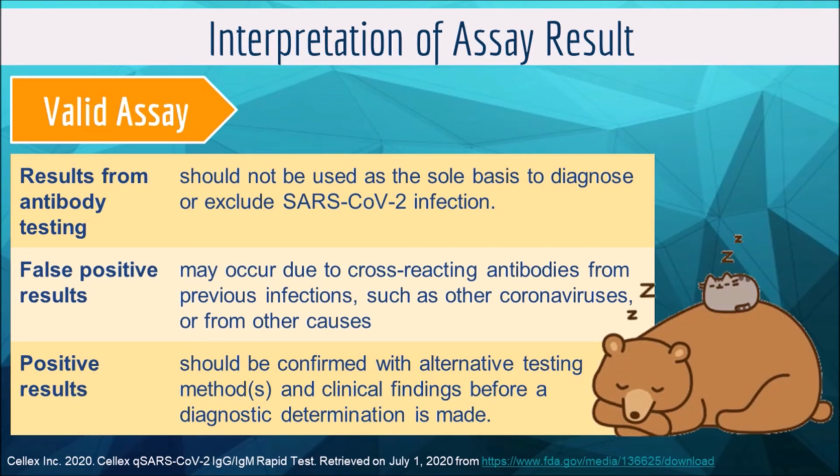And we have to know that the results from antibody testing should not be used as the only basis to diagnose or exclude this infection. False positive results may occur due to cross-reacting antibodies from previous infections, and the positive results should be further confirmed with alternative testing methods.